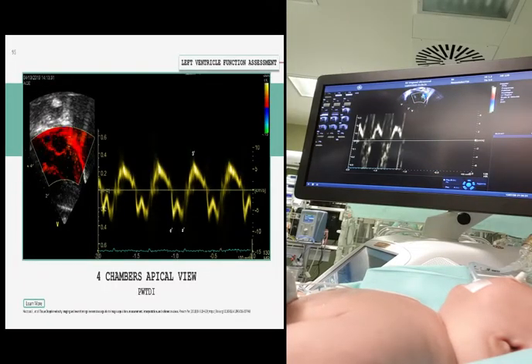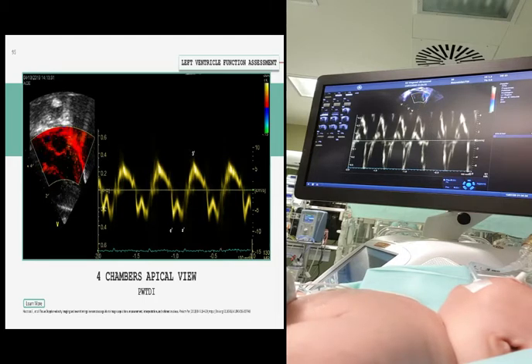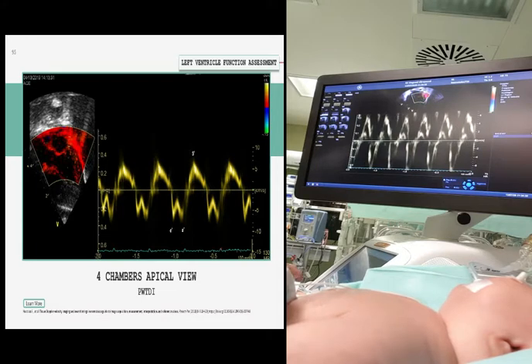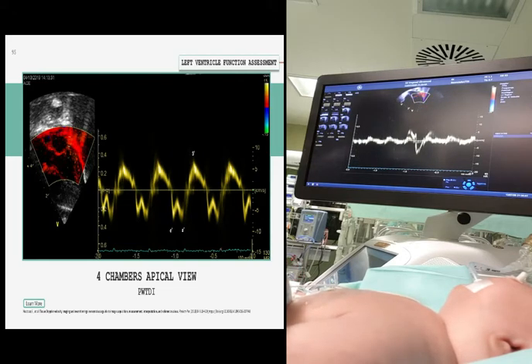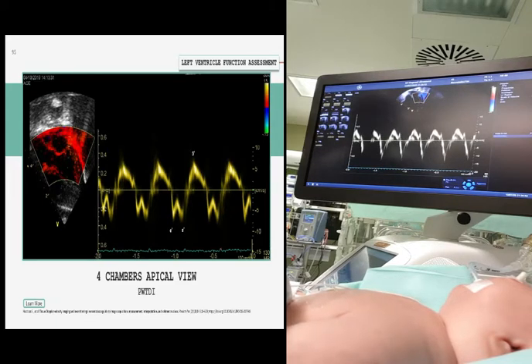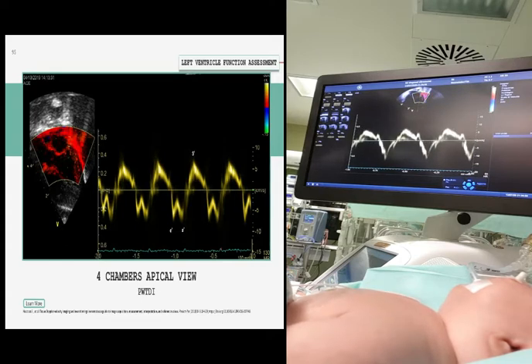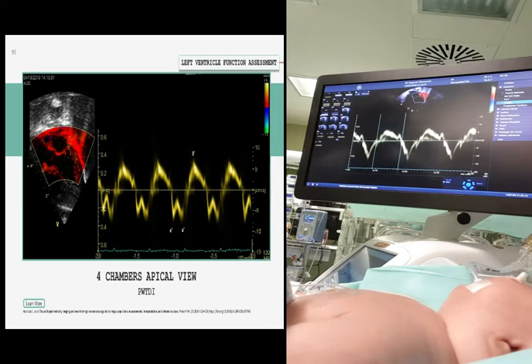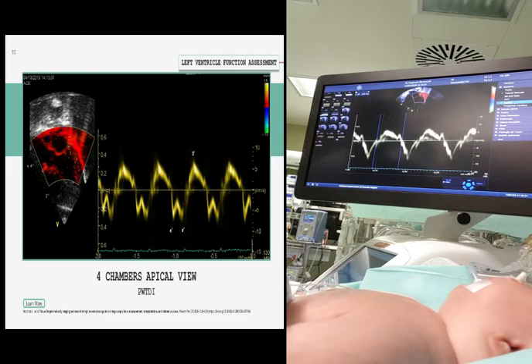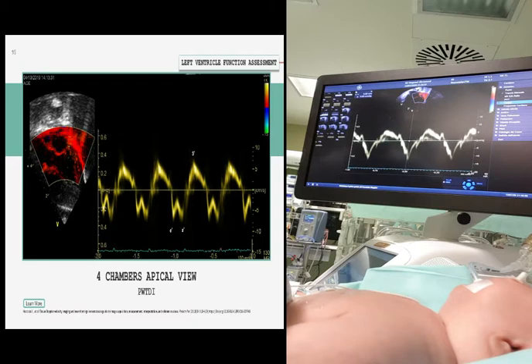The diastolic function of ventricles can also be assessed using tissue Doppler imaging, which allows measuring peak myocardial velocities using pulsed wave Doppler. With this technique, myocardial movement velocity is measured directly rather than the Doppler velocity of blood flow across valves. Depending upon the area of interest, a pulsed Doppler cursor is placed on the myocardial wall — mitral, septal, or tricuspid annulus — and peak myocardial velocities are recorded. Three waveforms are obtained: a peak systolic wave S, an early diastolic wave E, and an end diastolic wave A produced by atrial contraction. The S wave from mitral annular velocity has been shown to correlate with global left ventricular systolic myocardial function, while evaluation of E and A waves allows estimating ventricular diastolic function. Normative reference ranges in newborn infants have been published.